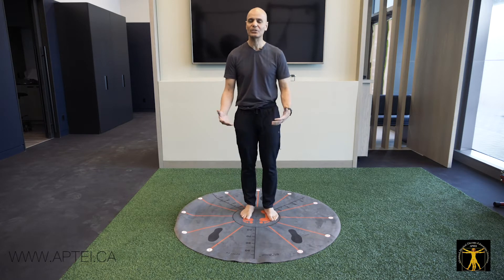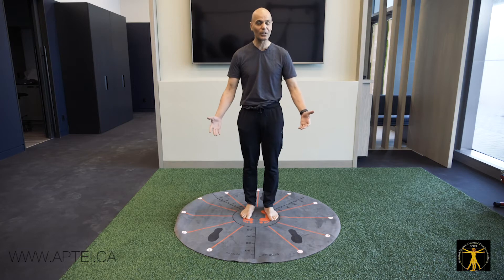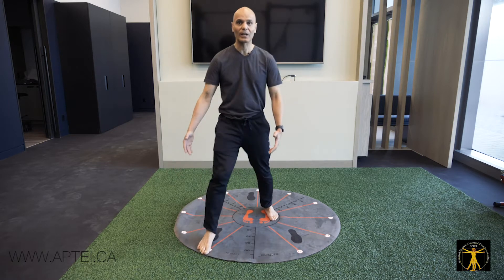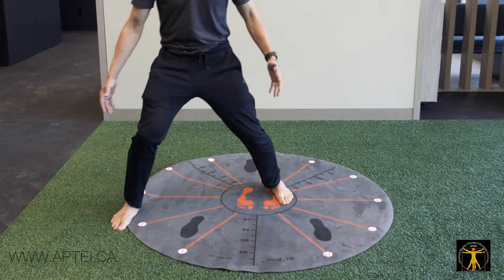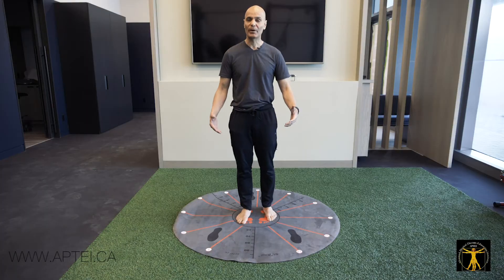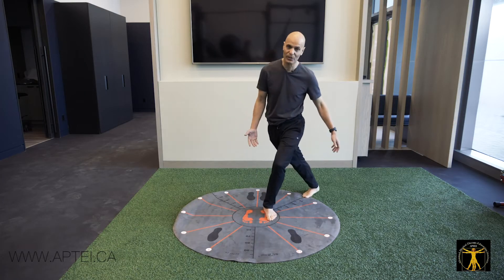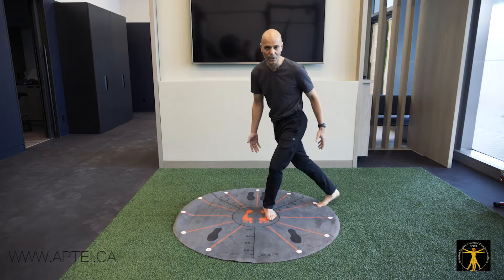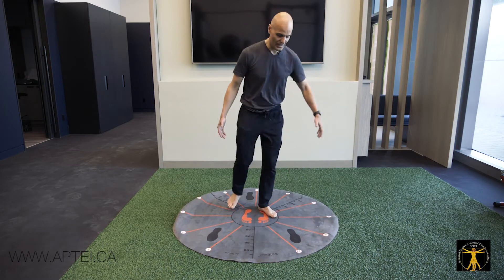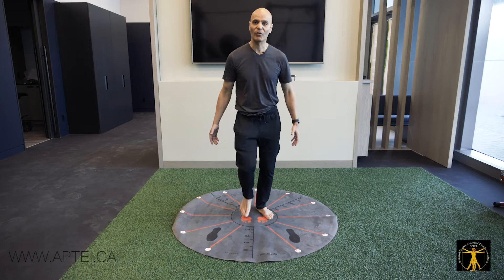This is for the elderly population or those at risk of falls. For the younger population, I progress to lunges, where the leg goes to 1 o'clock and come back, 2 o'clock and come back, 3 o'clock and so forth. I can do half the circle, then progress to the full circle — going to 7, 8, 9 o'clock from the front, then 10, 11, and 12 o'clock.